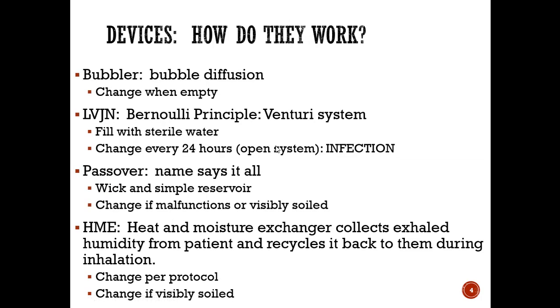The different devices and how they work. So the bubbler for the nasal cannula, you can change, and I would throw on all of these, change per hospital protocol, because some hospitals might have a protocol in place that's different than the manufacturer protocol, but change per protocol. For the bubbler, we change them when they're empty.